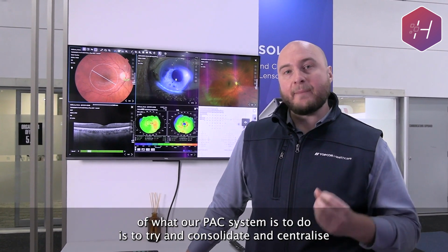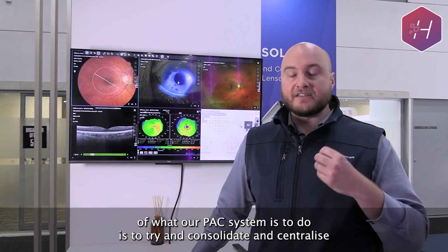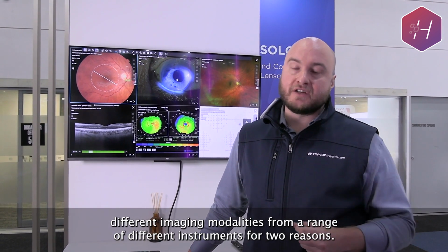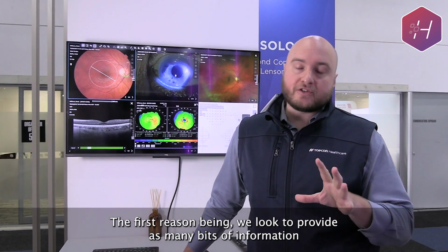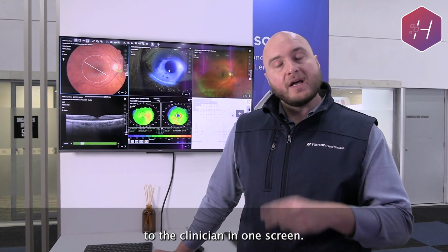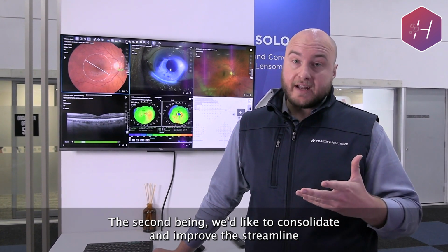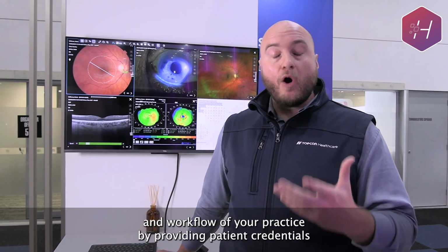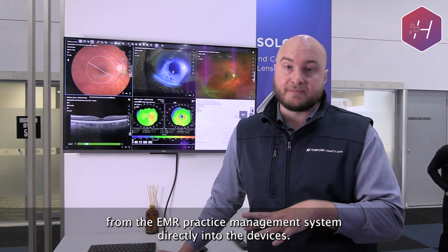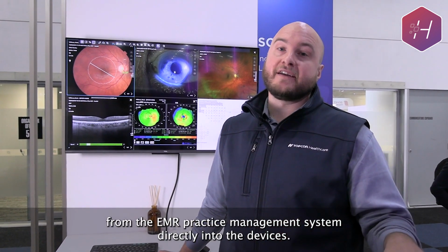The main goal of our PACS system is to try and consolidate and centralize different imaging modalities from a range of different instruments for two reasons. The first reason being, we look to provide as many bits of information to the clinician in one screen. The second being, we'd like to streamline and improve the workflow of your practice by providing patient credentials from the EMR practice management system directly into the devices. So let's have a look.